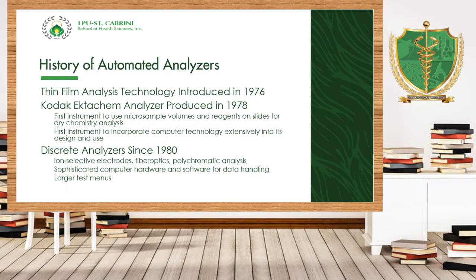analyzer is now known as the VITROS or the Ortho Diagnostic or the Ortho Clinical Diagnostics. This is the first clinical analyzer that was introduced, no, using the technology of dry chemistry. Okay, this is the first instrument to use microsamples, volume, and reagent.